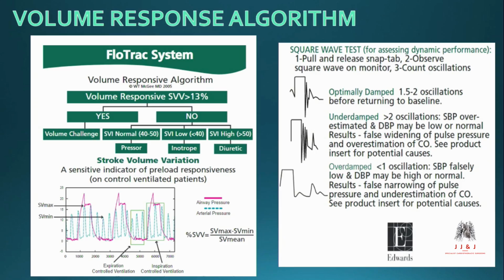But again, we do not just look at one reading or finding. We look at the patient as a whole. So then we look at our curve, which is, as you would see on that cardiac output monitor, that curve or waveform, and then there are the meanings on the side.